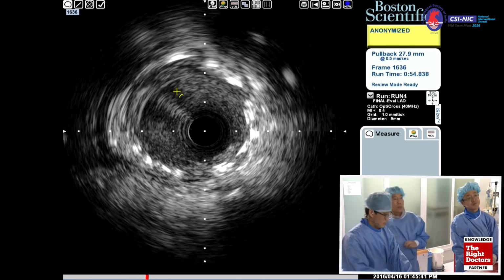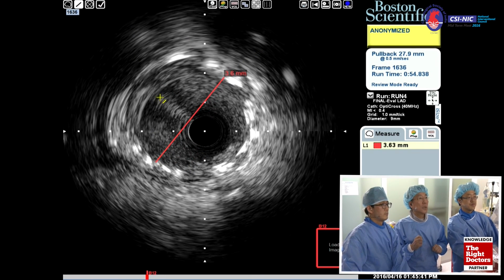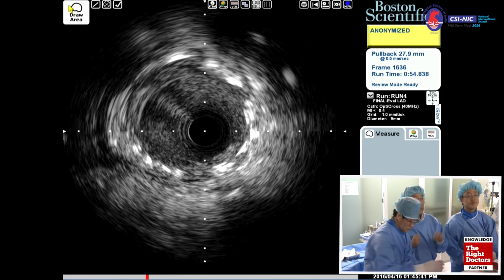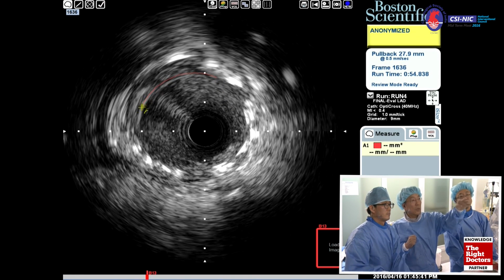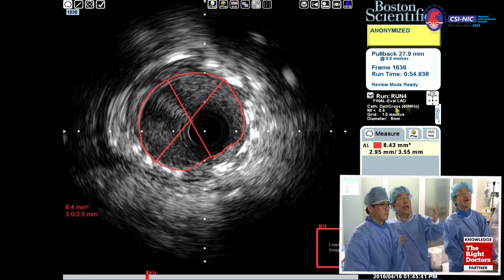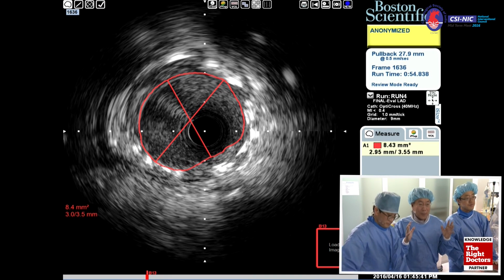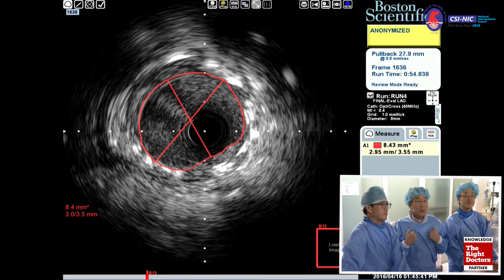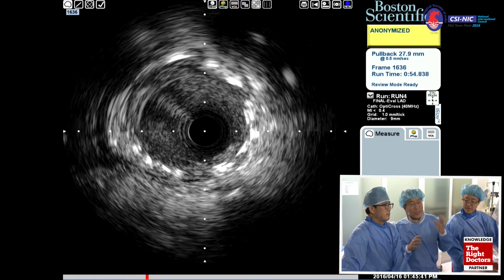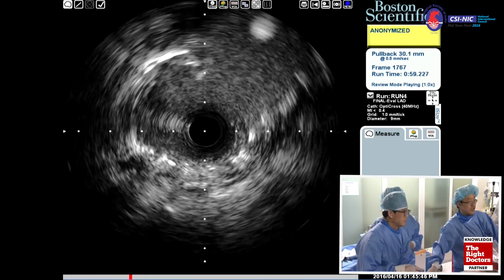So for the LAD proximal here, measure that. So you want to have some confidence in terms of stent diameters and area. There is some still remaining intima hyperplasia. Okay, good, perfect. Lumen area is almost 8.4 millimeters square. It's great. The meaning is big enough, and with the drug-eluting balloon we expect good clinical outcomes. Stent area is the most important predictor for long-term clinical outcomes. So, we will check the final angio.